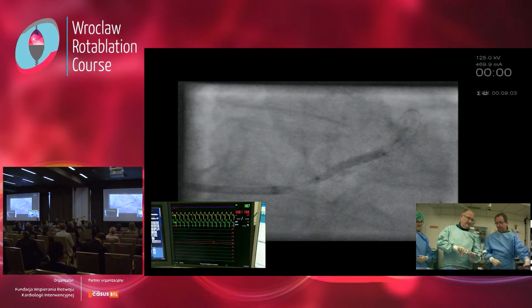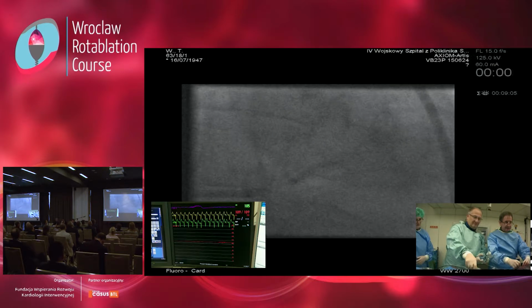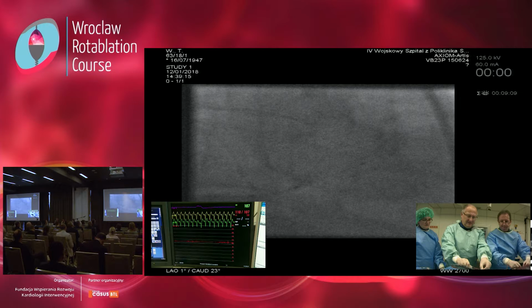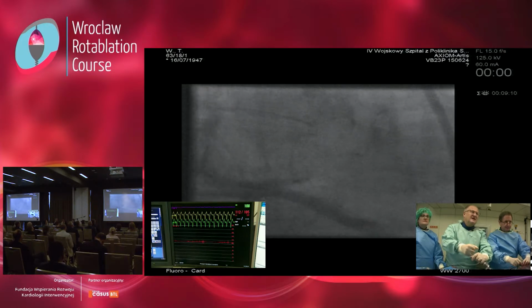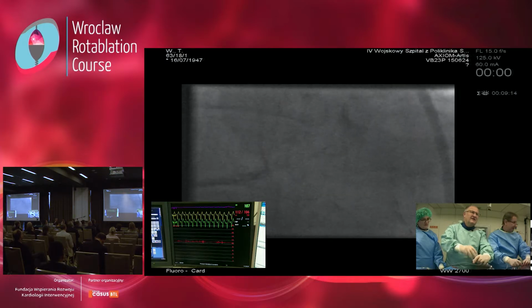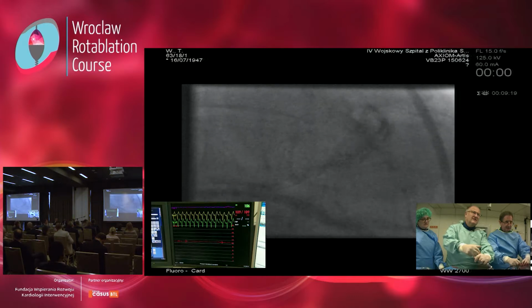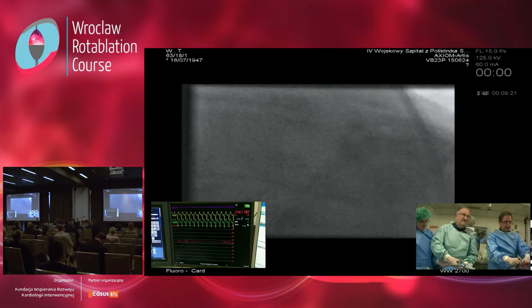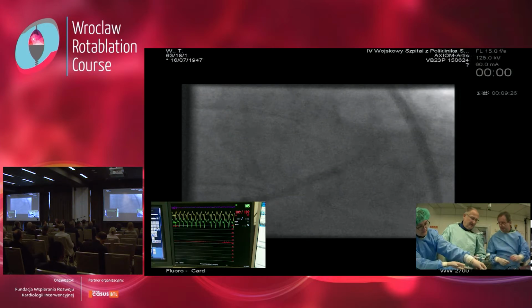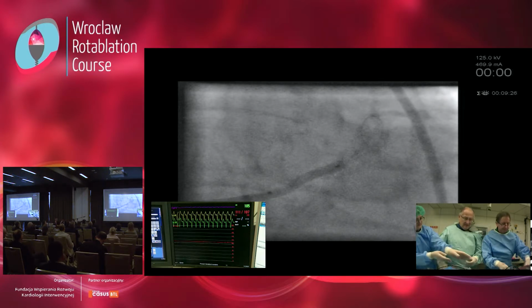No, 20. Negative. So test. I think the balloon was moving forward. I have the impression. Okay. Check. Test. Yeah, a bit back. Don't move. Check. Okay, one more. Okay, 20, 22. Okay, negative.